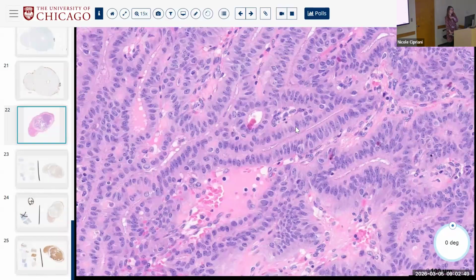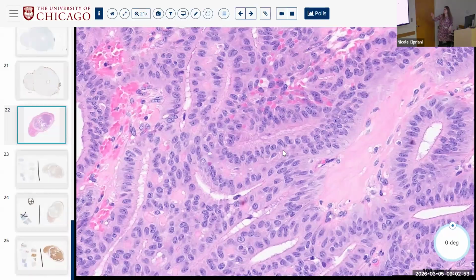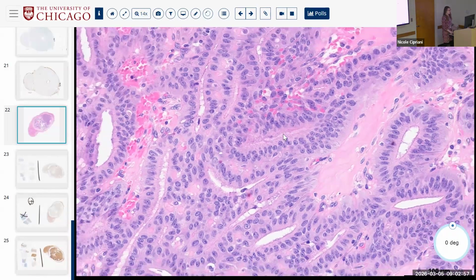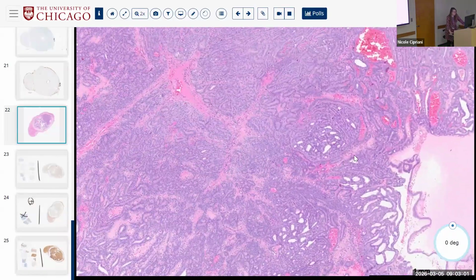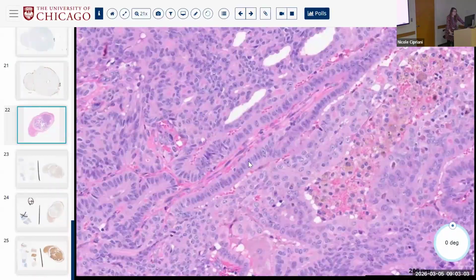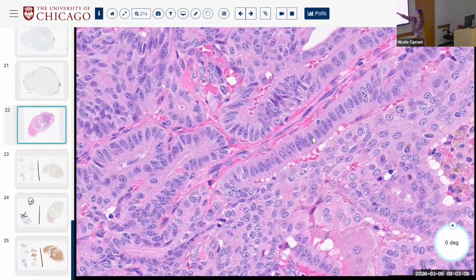Don't always say, oh yeah, there's papillae, there's some solid growth, cool, it's PTC, next case. No, these are not the nuclei of PTC. This growth pattern with these punched out cribriform spaces, and almost columnar morphology, you guys mentioned columnar before. There is an overlap between columnar carcinoma and cribriform morular.